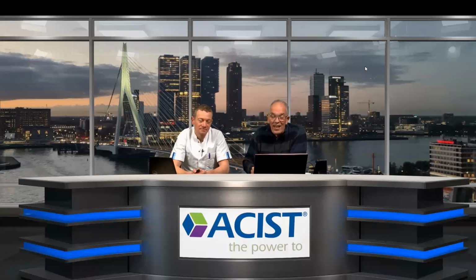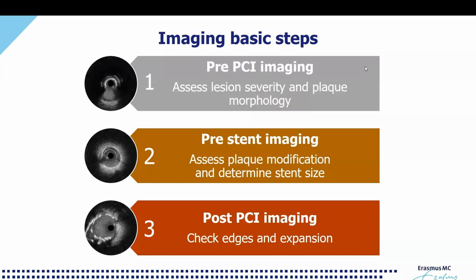And just before, I think it's even better to skip the pre-PCI imaging if you already suspect that there is calcium, and do a pre-dilatation or rotablator or whatever, but never skip the imaging after the pre-dilatation or preparation. Never skip that one. And then you know what you're dealing with, and whether the resistance is there. And then, of course, post-PCI imaging, that's always good to check your work. Always check your work.